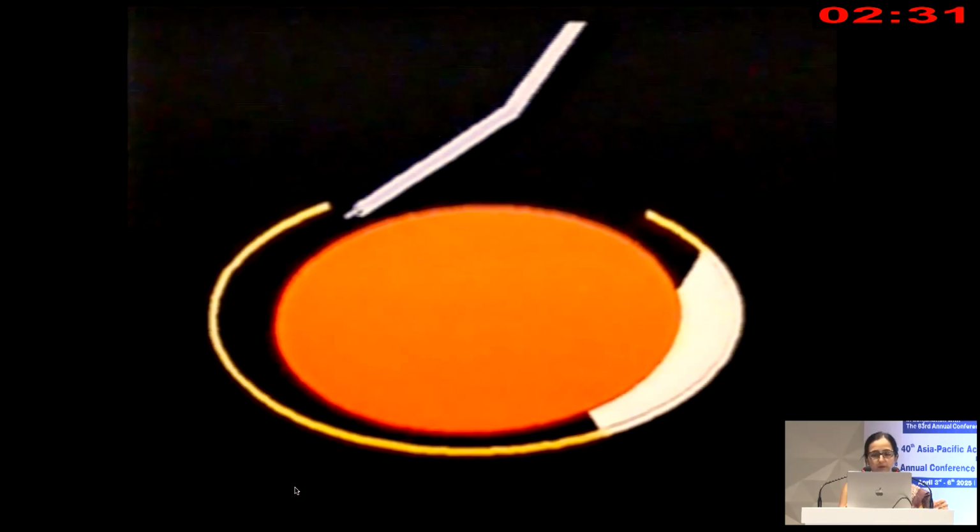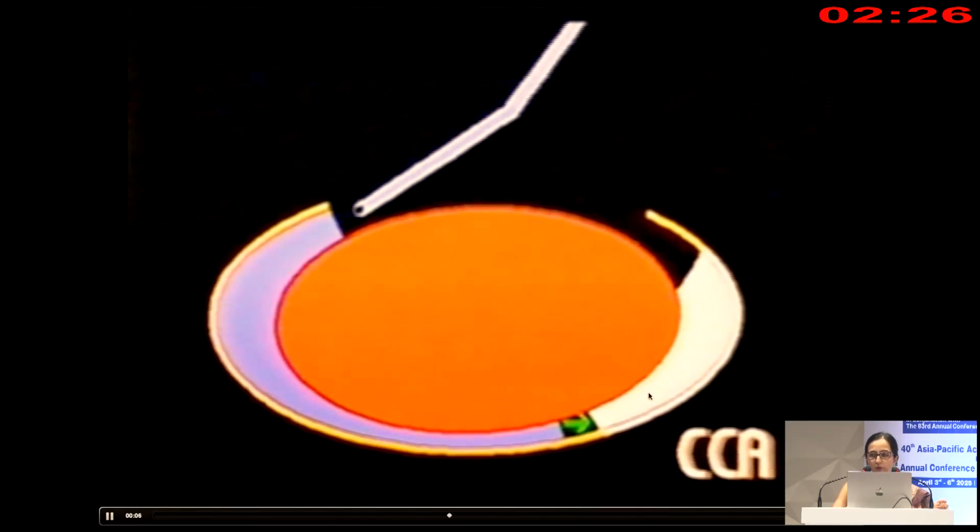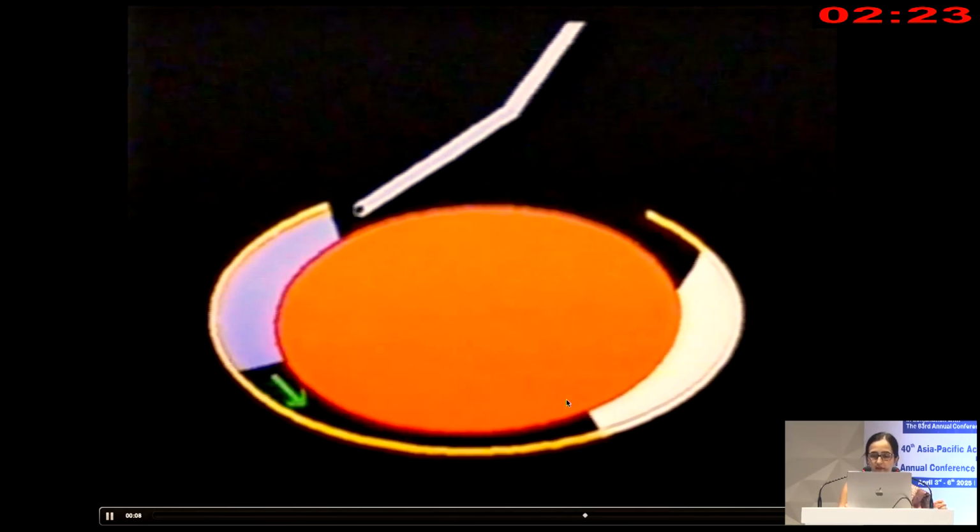So this is what we call a CCA or a corticocapsular adhesion, whereas here, this is a diagrammatic representation, and this is what it would clinically look like on the slit lamp. You will see some space between that cortical opacity, so this is not a true capsular adhesion. So this is important to see in pre-op with a fully dilated pupil, so that particularly when you are in a training center or you have multiple surgeons, the person doing the pre-op should mention that this patient has CCA, so that you do a multi-quadrant hydrodissection preemptively. Because as we can easily understand, these adhesions will actually block or stop the passage of a successful wave.